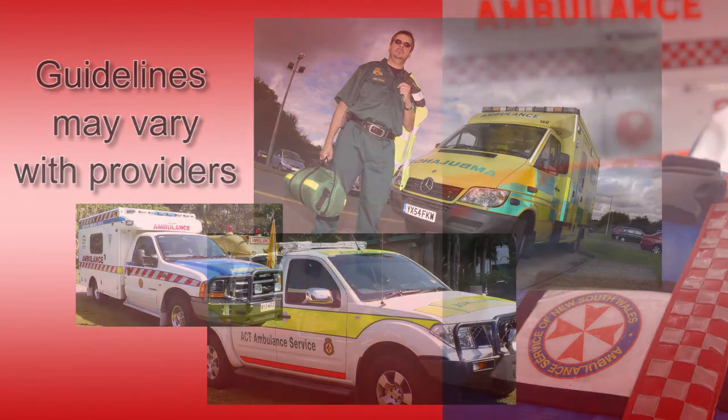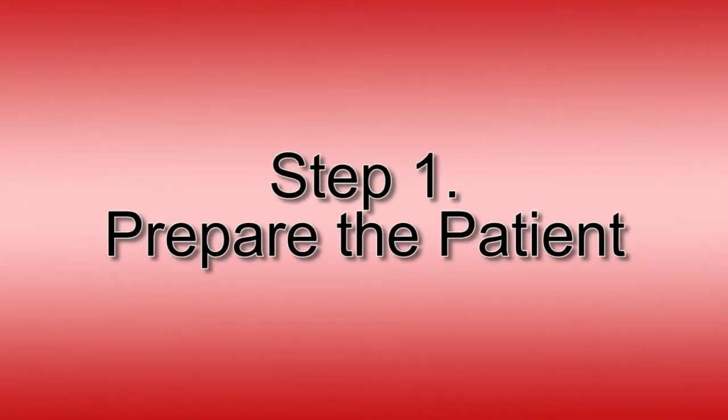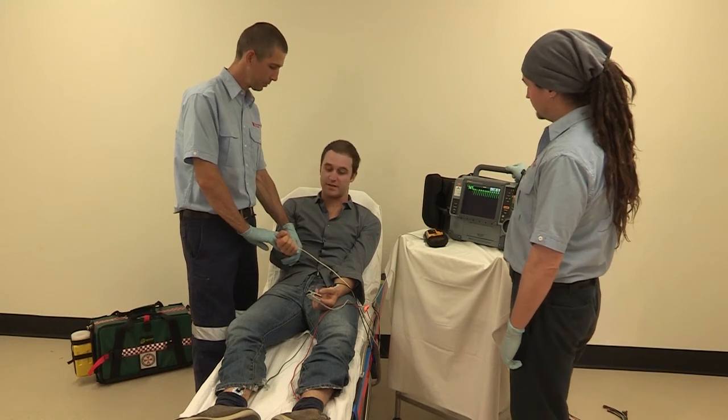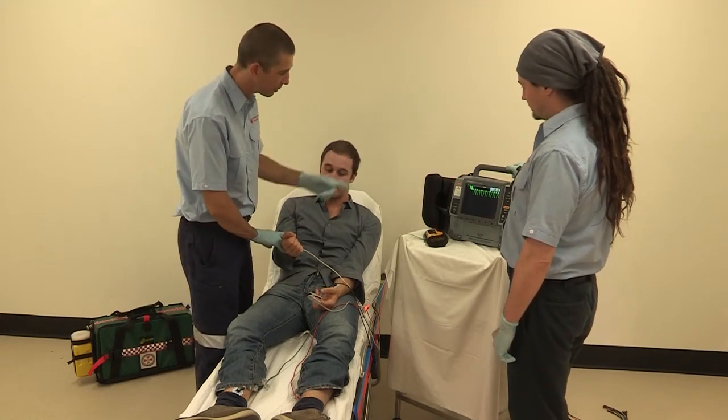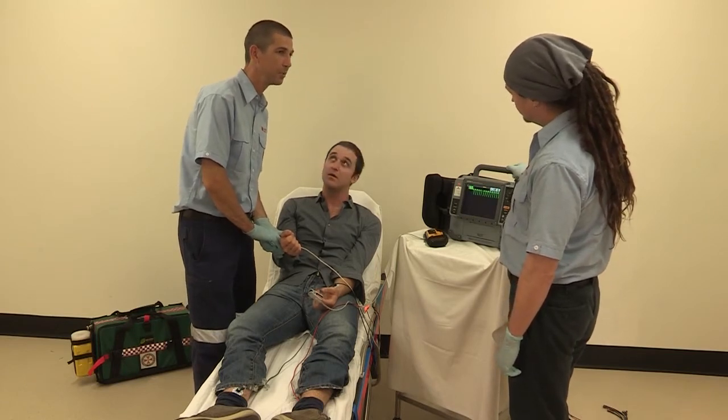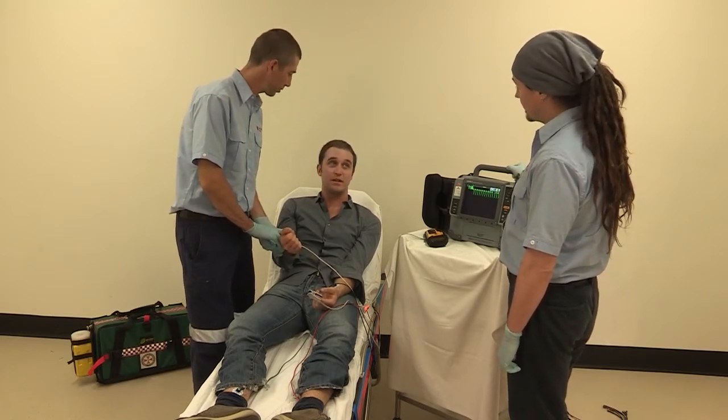Let's look at the steps to perform this skill. You will find the patient conscious, but if they are not, then they may be in cardiac arrest. You need to check your ABCs and reassess. You note on the monitor for this example that the patient is in VT.